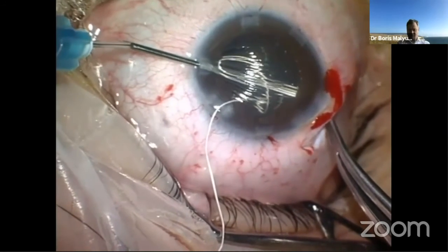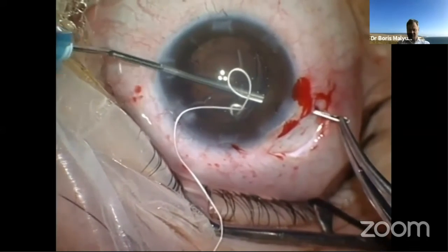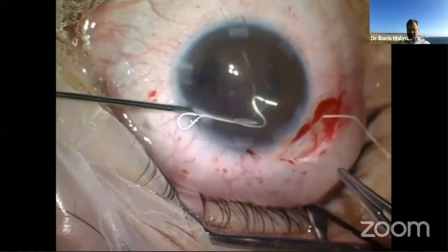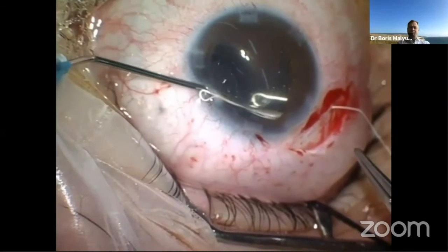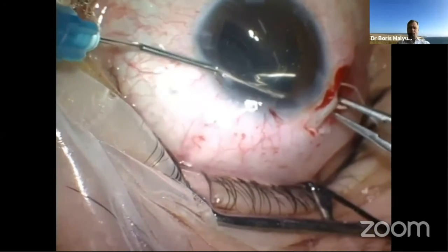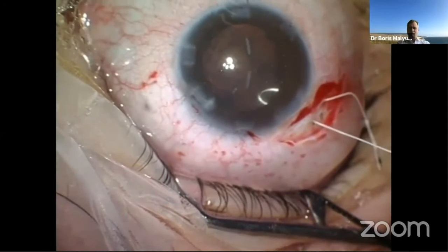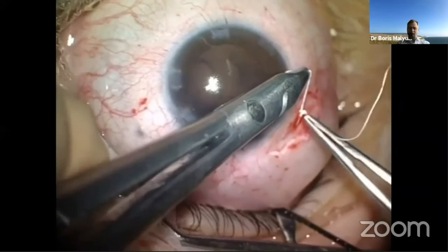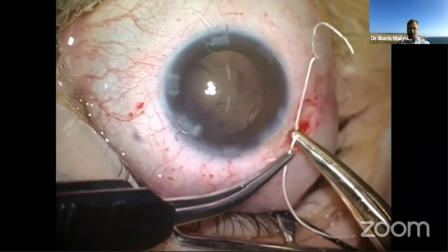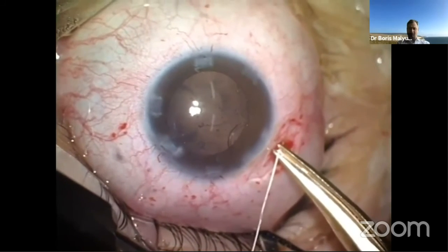As shown here, this is one tip of that suture that is passed through the sclera, and I will be using the same needle to pass the second portion of that suture and again go out from the eye in the area adjacent to the first exit. The ends of the suture are trimmed, and it's time to implant the IOL into the capsular bag, because the latter is stabilized with the CTR fixed to the sclera.